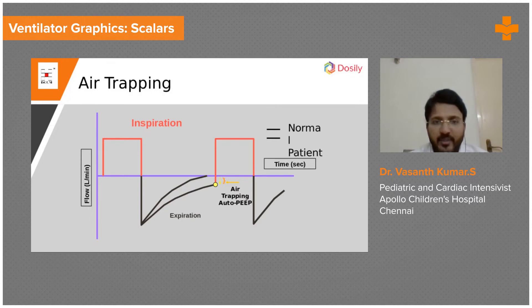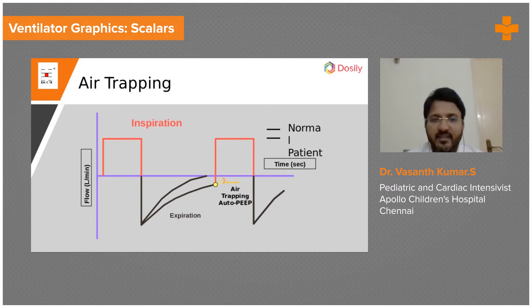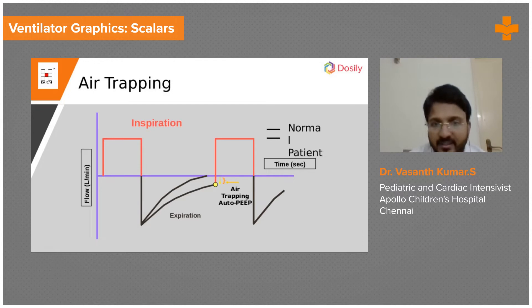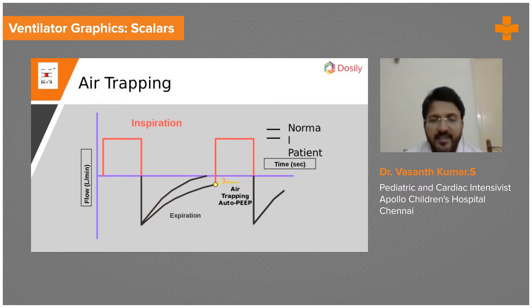Here you can see the inspiratory flow is a square waveform. The normal expiration should reach baseline here, but the expiration is taking longer to reach baseline before the next breath starts — this means there is a problem with expiration. This can be seen in conditions like asthma with bronchial obstruction or COPD where expiratory airflow is limited. You can see scooping here, and there is auto-PEEP — extra pressure generated because air is still remaining in the alveoli at end expiration. This air trapping at end expiration is called auto-PEEP.